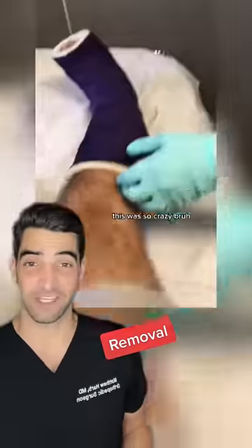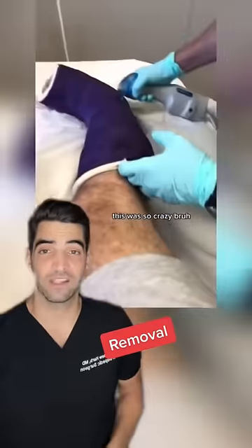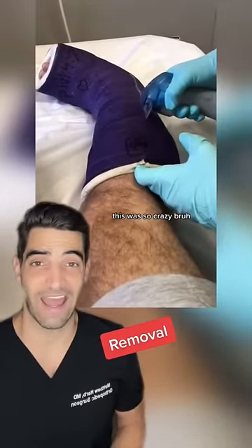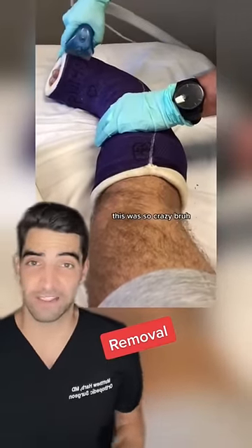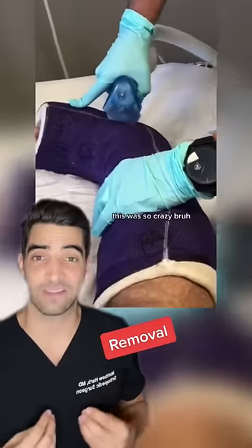After he does this bivalve technique and cuts both sides, there's a certain technique for doing this. You can see here, he always keeps one finger on the cast while he's using the saw. This is to prevent the saw from plunging deep into the skin. The saw blade vibrates back and forth, and there's a little vent on the saw that allows it to suck all the cast debris away.